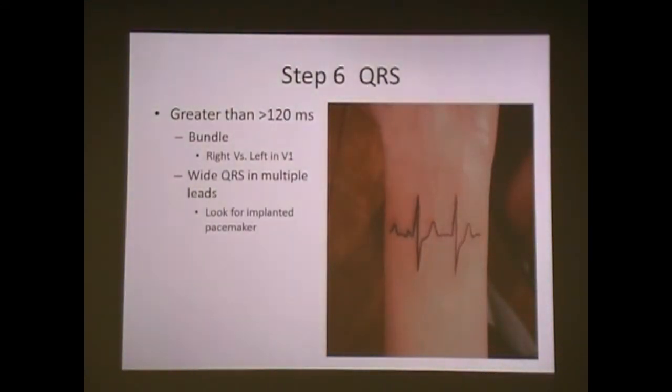Okay. Kind of a rule, I do this on all my patients that are cardiac. As I go up and talk to them, I put my hand on their left side of the chest and just touch it right there. I'm generally going to tell. I'd say 85% of all pacemakers I put in are on the left. The reason initially was that people were shooting shotguns and those kind of things, and most people are right-handed, so the things that they put up to their shoulder are generally on the right.